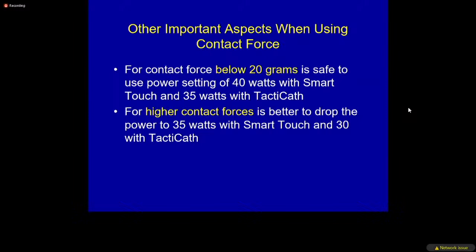Those are irrigation catheters with temperature-driven power. So you don't do anything. The system goes up to a maximum of 50 watts based on tissue temperature down to 2-3 millimeters without you having to dial anything. So that's much more objective, but you still control the duration that I mentioned, at least 10 seconds, and the contact force.